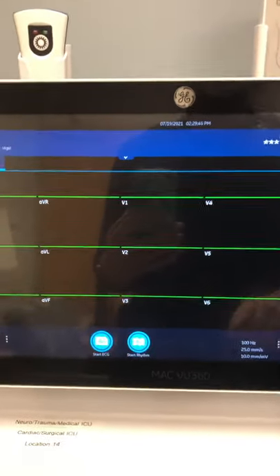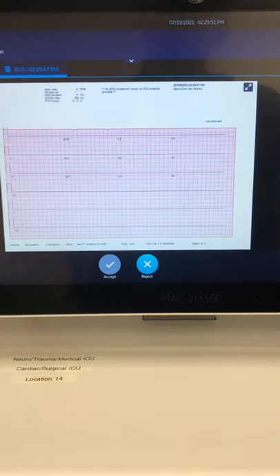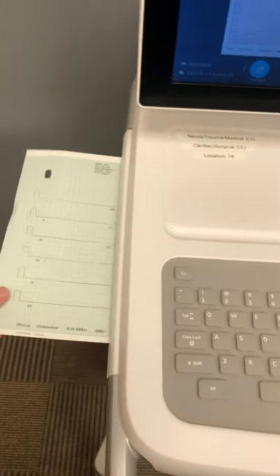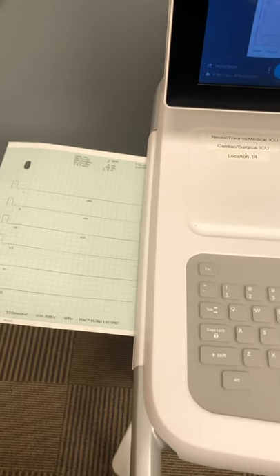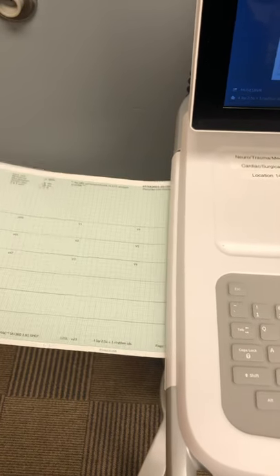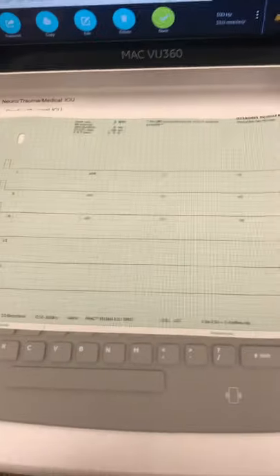Then I can hit Start EKG again, the preview comes up, and if that's the one I want, I hit Accept. By hitting Accept, it starts printing off the report from the left side of the machine. The EKG has a perforated edge, so all you have to do is pull it off and you have your physical EKG.